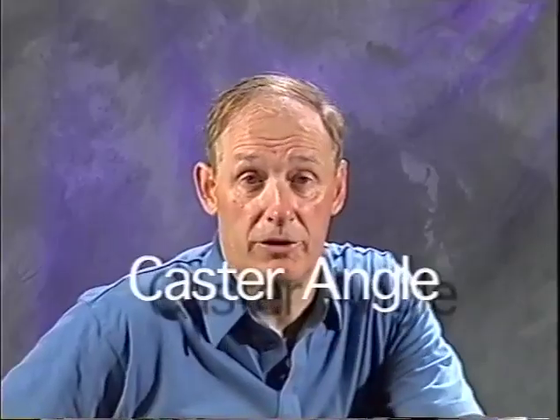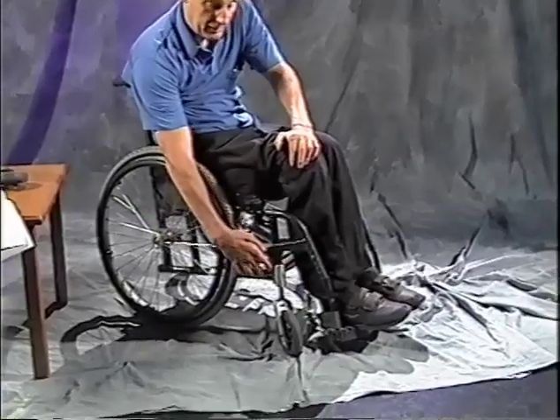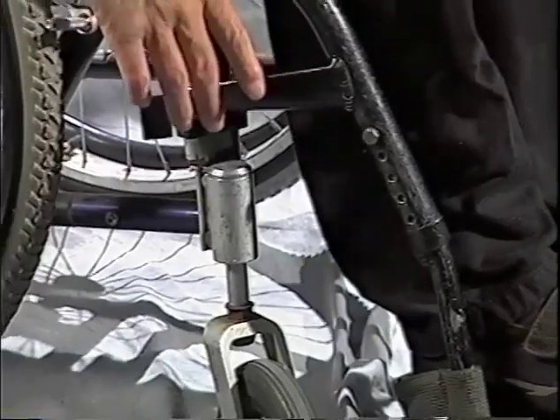Once you've determined the seat dump on the chair and have moved the axle plate to wherever it's going to be staying, then you need to adjust your caster angle. And that is done with 2 bolts on most of these chairs. These are eccentric bolts, and you can turn the caster to make it 90 degrees to the floor.